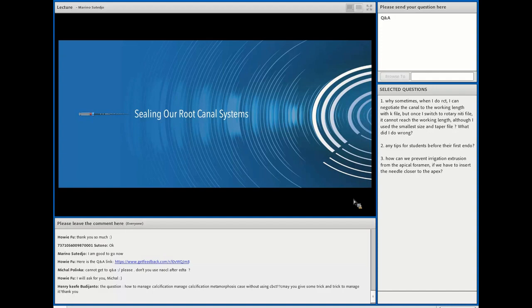But if you put your K file in and in the middle of nowhere you feel that you need to add a little more pressure, it means don't do it. Immediately take the K file out, because it is not safe to use a K file in that case. I directly jump into my rotary instrumentation, in this case my rotary glide path. That's my personal opinion, and it's safer that way compared to pushing the manual file into the length.